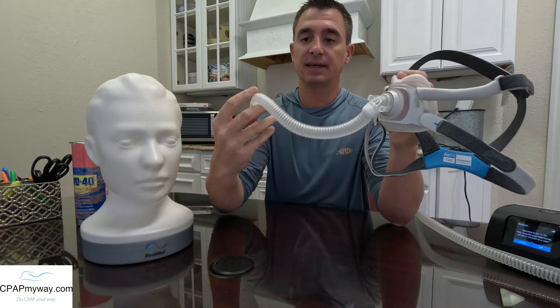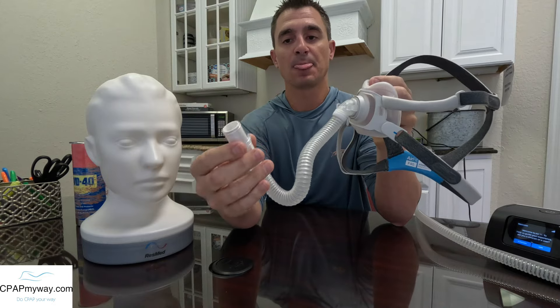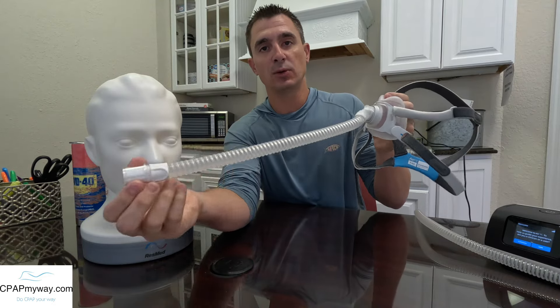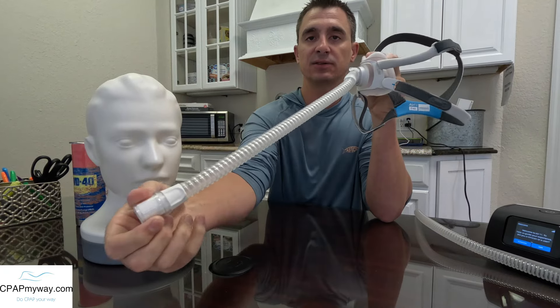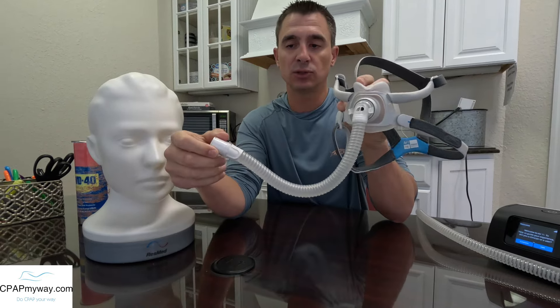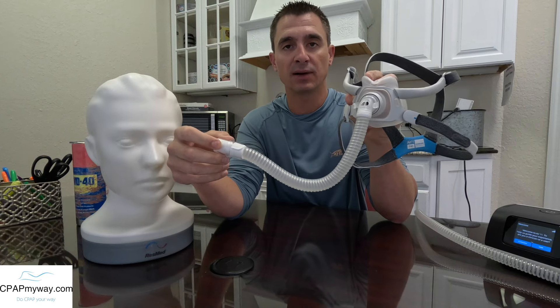Another big change is the extension tubing. This tubing is built to give you a lot more stretch and give as you move side to side in bed. It rotates really easily and gives a good bit of stretch — a lot less tube drag than the F30 model.